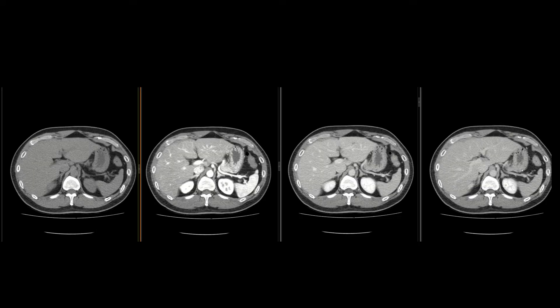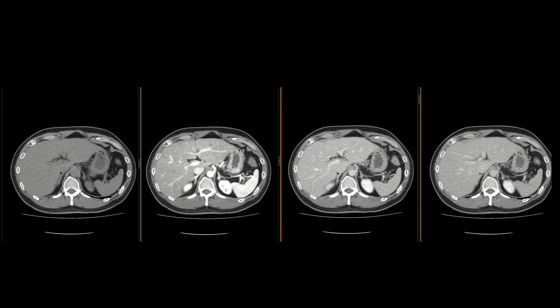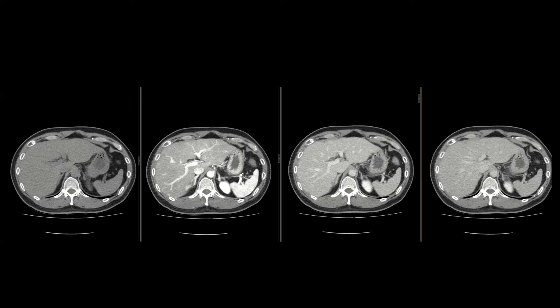In routine imaging of the entire abdomen and pelvis, we most commonly image in portal venous phase, so we most commonly see the liver in portal venous phase. We also not uncommonly image without contrast, so you'll see the liver on non-contrast quite a bit as well. For dedicated liver evaluation — like characterizing liver lesions — we're going to see all of these phases together on the same examination.